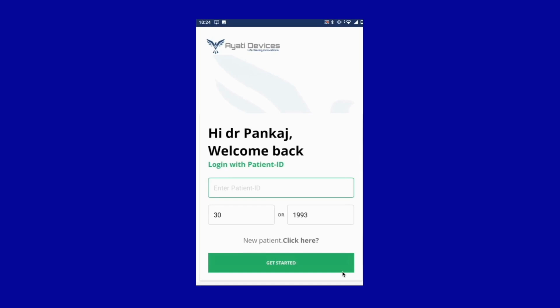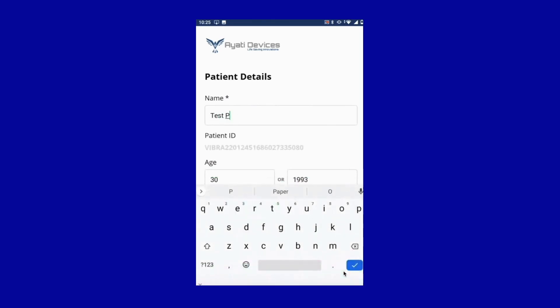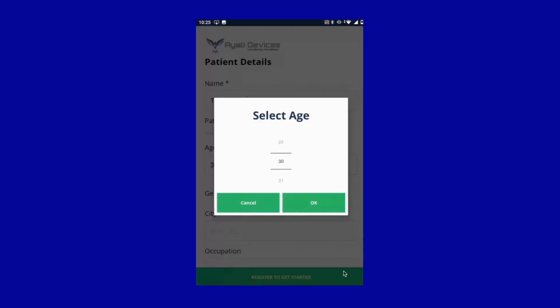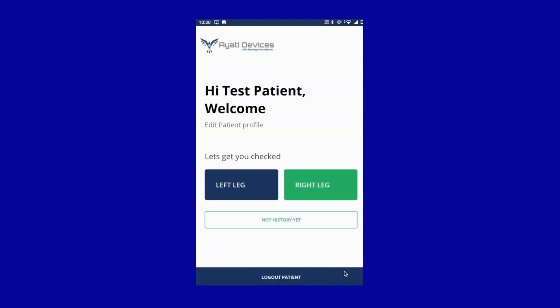On the subsequent screen, click on new patient, enter the patient details, and click on the register to get started button. The app will now show a screen with options for right and left leg. You can now proceed to the next step.